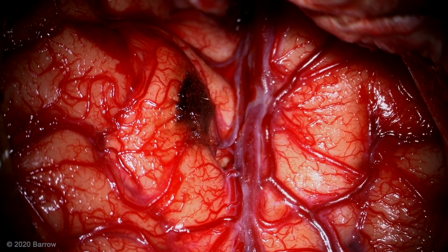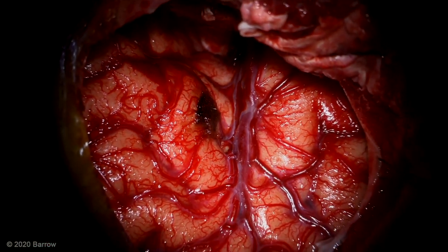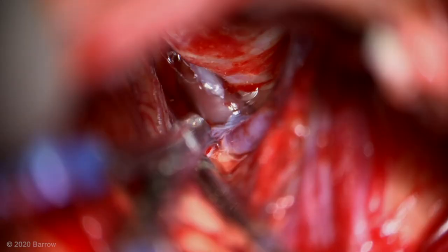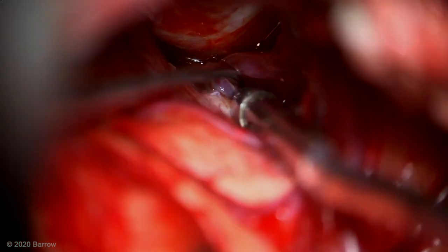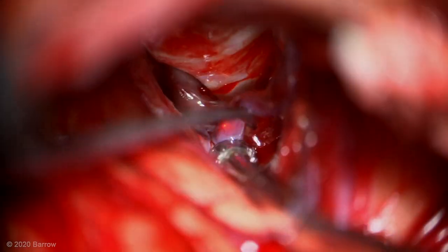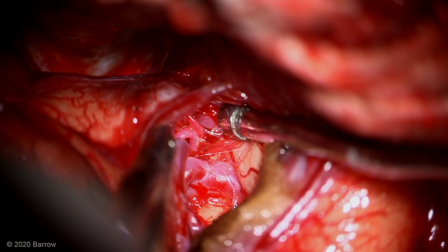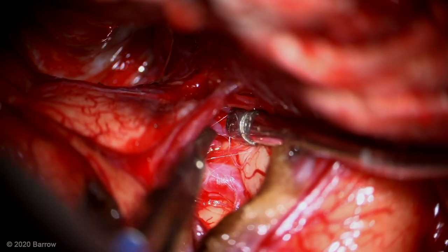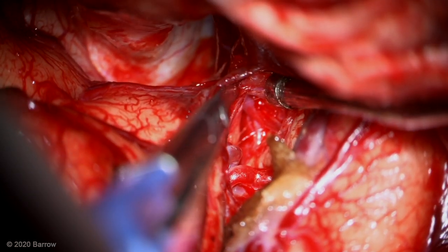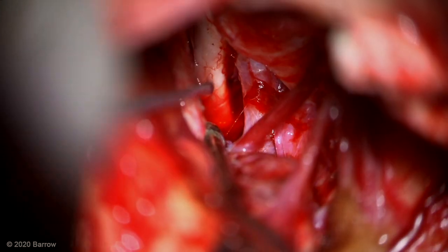Here is an overview of the surgical corridor. The frontal lobe is to your left, the temporal lobe to your right. This is the view down the sylvian fissure, dissecting these bridging sylvian veins to preserve them. Here the sylvian fissure is split further and you can see the dense adhesions between the frontal and temporal lobe at the anterior aspect of the fissure.